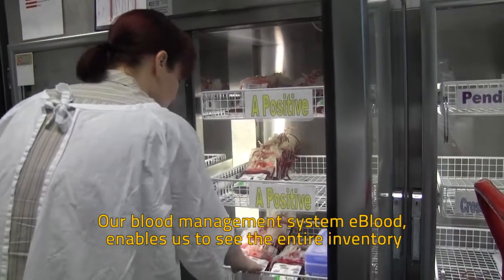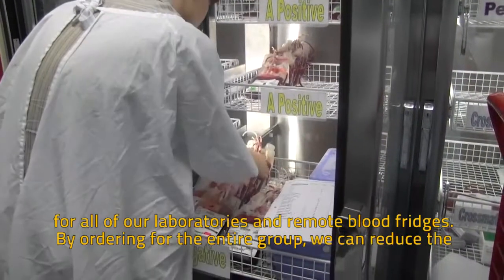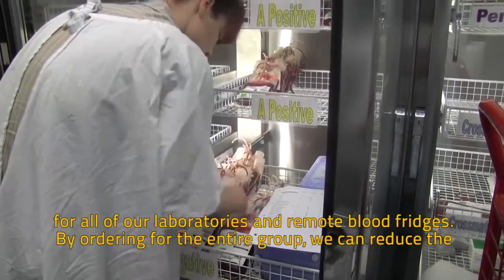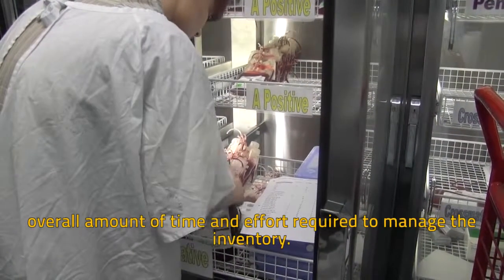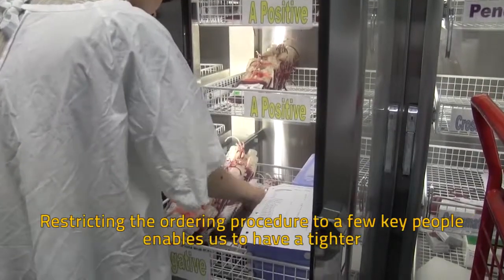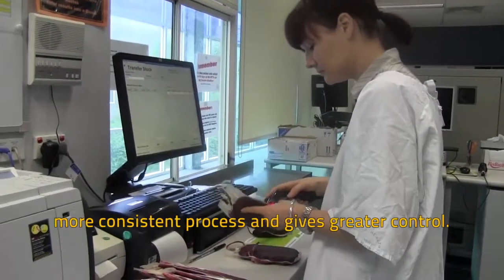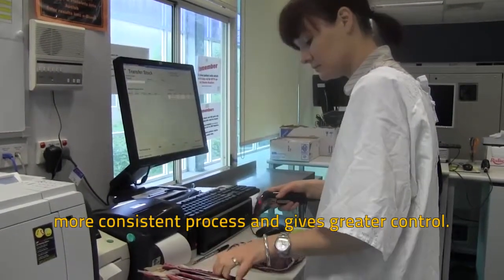Our blood management system eBlood enables us to see the entire inventory for all of our laboratories and remote blood fridges. By ordering for the entire group we can reduce the overall amount of time and effort required to manage the inventory. Restricting the ordering procedure to a few key people enables us to have a tighter and more consistent process and gives greater control.